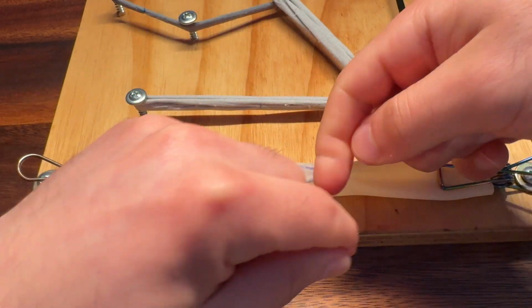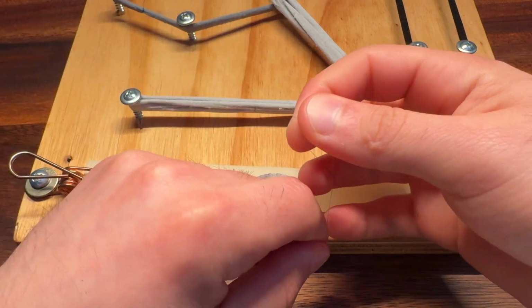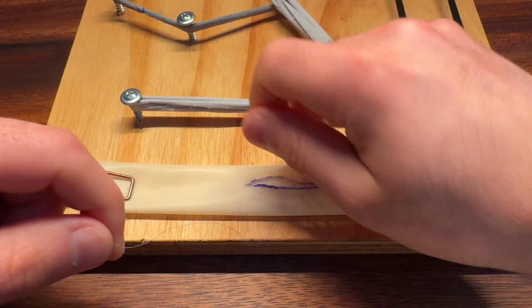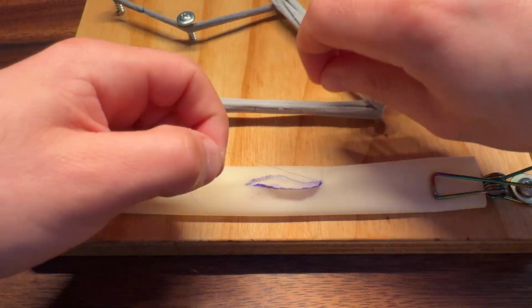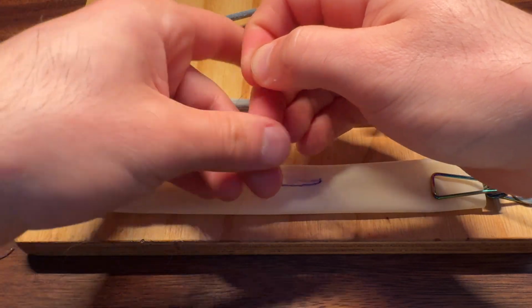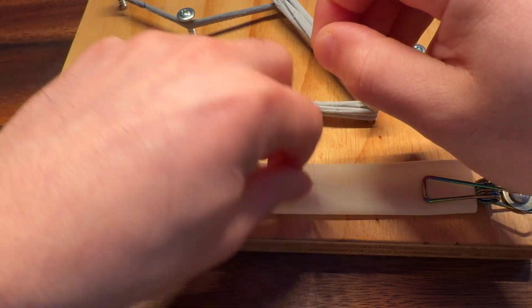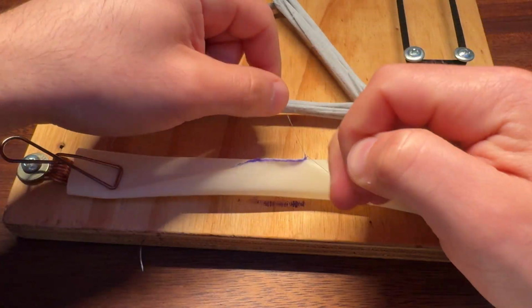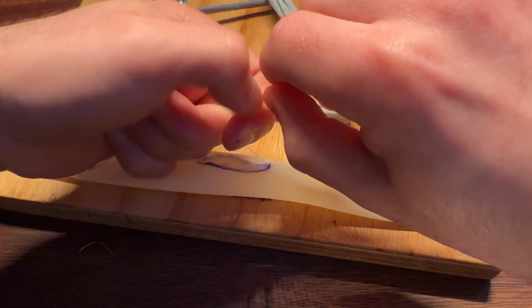I think with the hand ties, you can get a very good feel of how tight things are and the tension that you're putting on the string. If I did leave my tail a little bit short, it is somewhat difficult to make these throws, especially the front hand one-handed. In that case, you can always switch to a two-handed technique. The two-handed technique is done basically on the side that's a little bit longer. So this is a little bit longer side, and the needle end is the one that you're turning around.